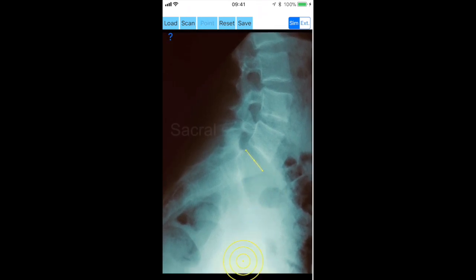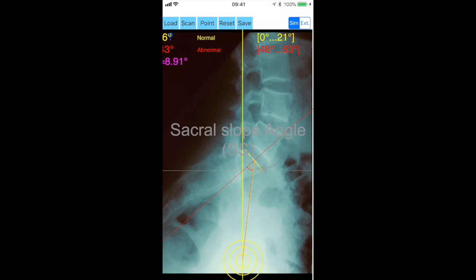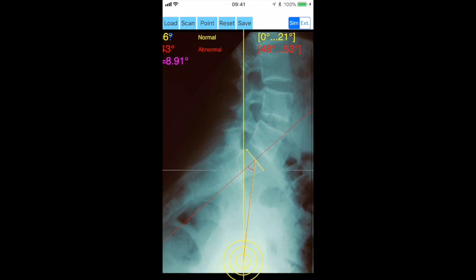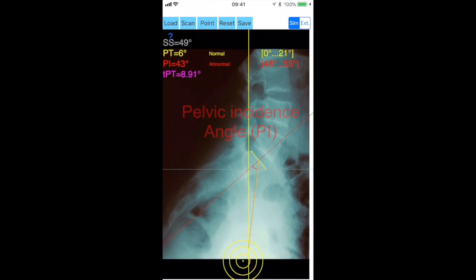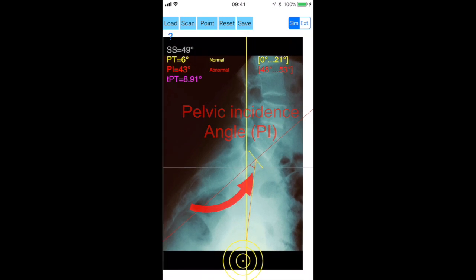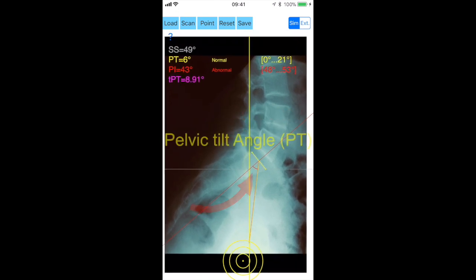Automatically the pelvic incidence angle (PI), sacral slope angle (SS), and pelvic tilt angle (PT) are calculated.